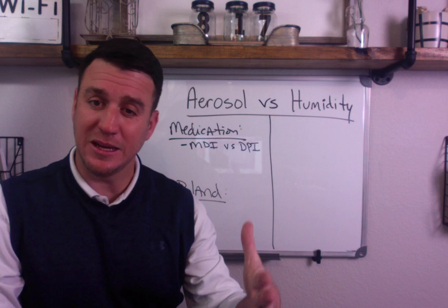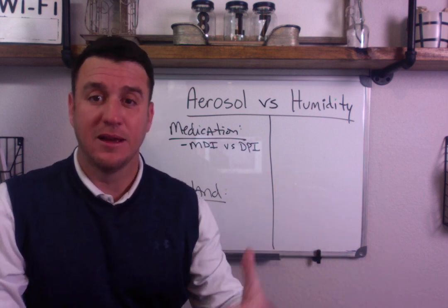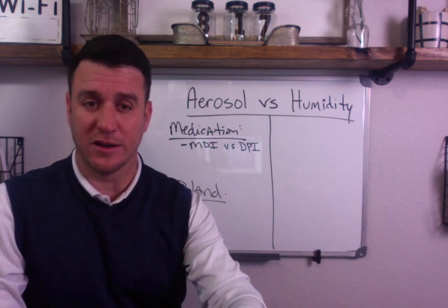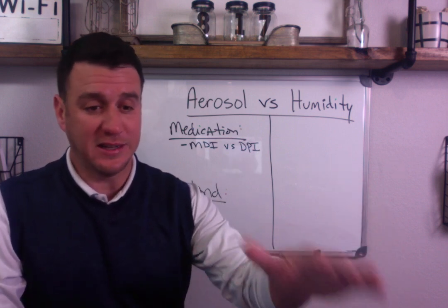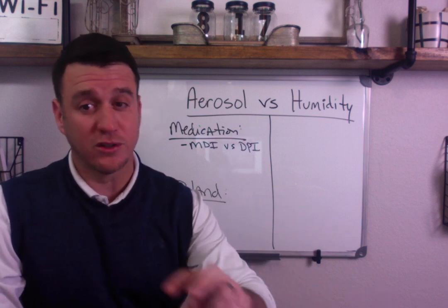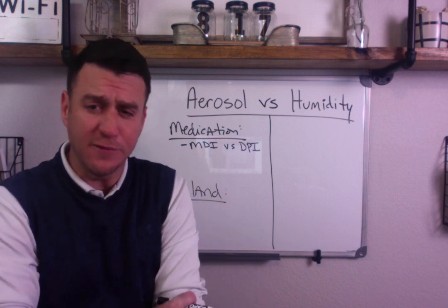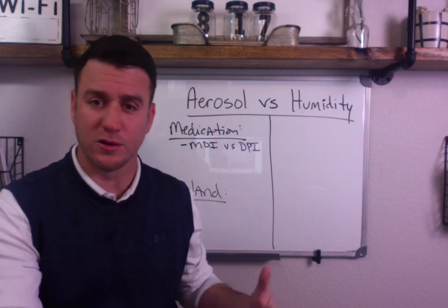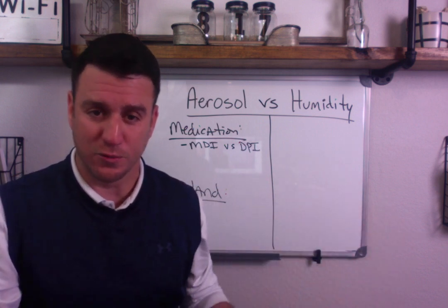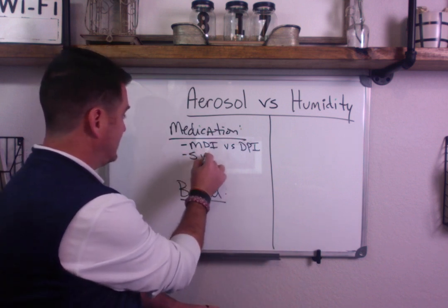So the difference is MDI is deep and slow. DPI is deep and fast. You've got to start there when you're talking about aerosol devices. If I didn't put MDIs in here, I'd be doing you a disservice. Okay, so understand those two differences between those devices right there. And of course, if you're delivering a corticosteroid, whether it's MDI or DPI, always have your patient rinse their mouth, right?